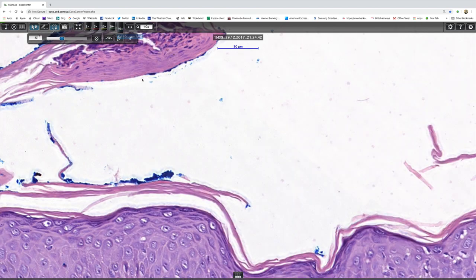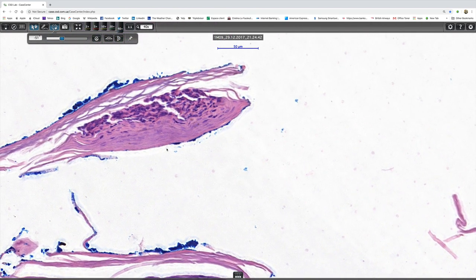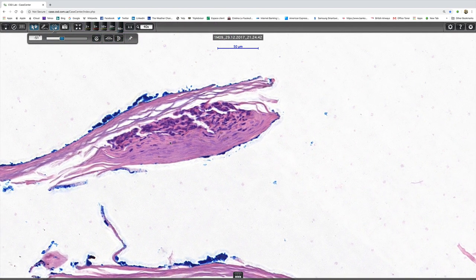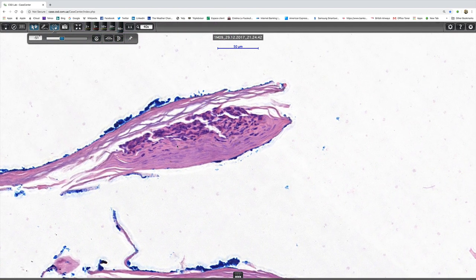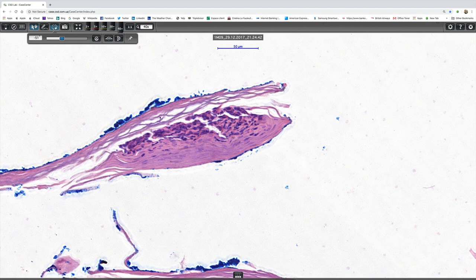And I don't know whether there's a times 40. And so you can see orthokeratosis, parakeratosis, and neutrophils in the middle.